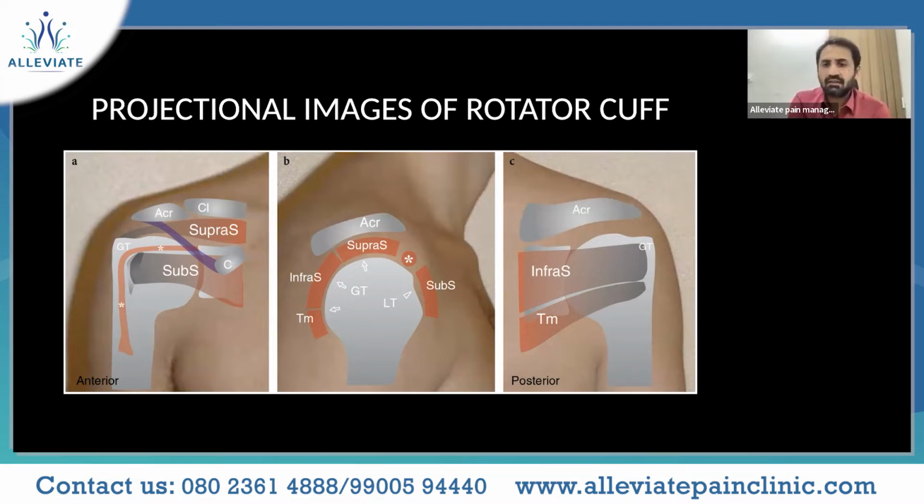In this case, you can see the acromion, the clavicle, the coracoid process, the ligaments around the area, the subscapularis, and the supraspinatus coming and attaching to your greater tuberosity. The asterisk is your biceps tendon. In the sagittal view, you can see the supraspinatus, your biceps tendon, your subscapularis anteriorly, your infraspinatus and teres minor, and the acromion. Here posteriorly, you can see the infraspinatus and the teres.